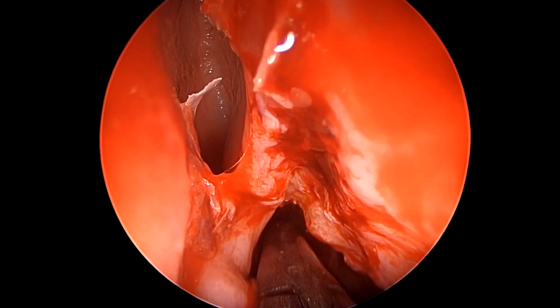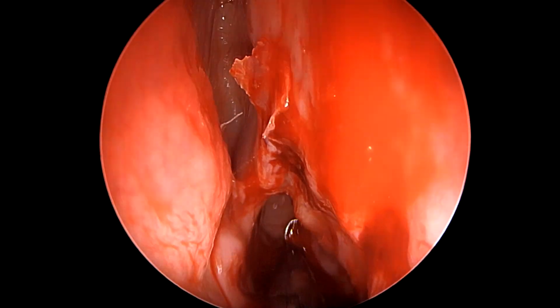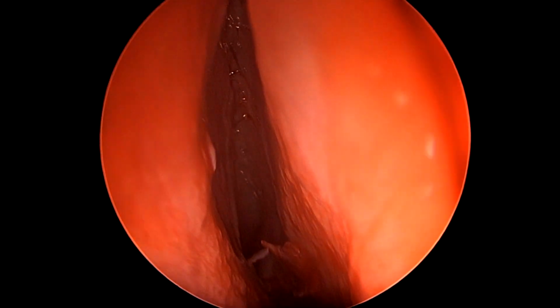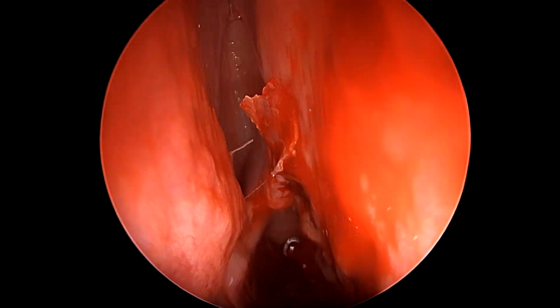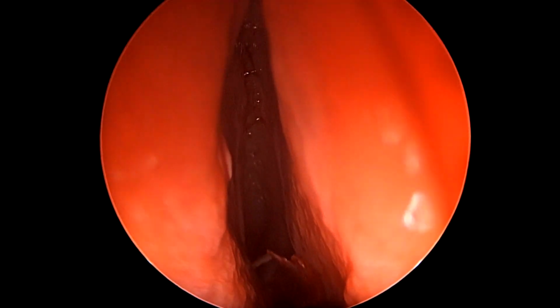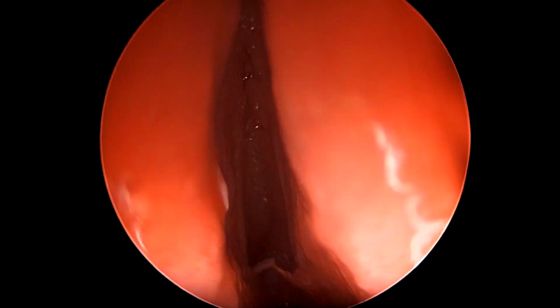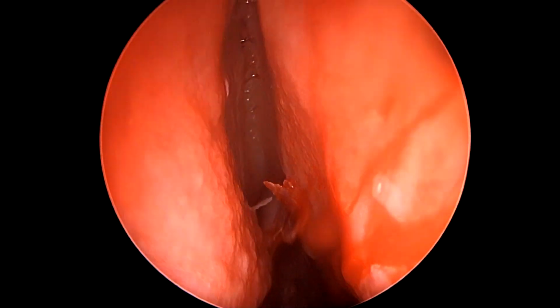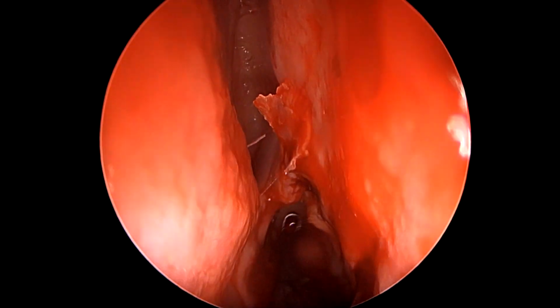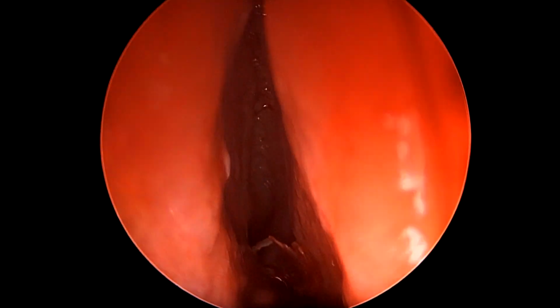We are looking superiorly. We are articulating our punch. We are engaging the lip of the frontal beak onto the punch superiorly and sometimes slightly lateral. One must be mindful of the orbit, not causing an orbital breach, because if the orbital periosteum is breached, the fat will start to protrude and will obviously obscure our access and our entry inside the frontal recess and the frontal sinus.